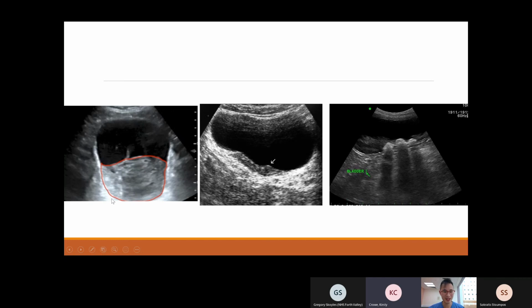And over here it's difficult to see whether it's shadowed or not. But okay, so this is a collection. It's a very complex collection. It's not a simple sort of sawdust collection. What do you think this might be? A complex collection. Well, I don't know. Either some kind of horrible abscess or some sort of malignancy. I don't know. Could be. So this actually is a hematoma.